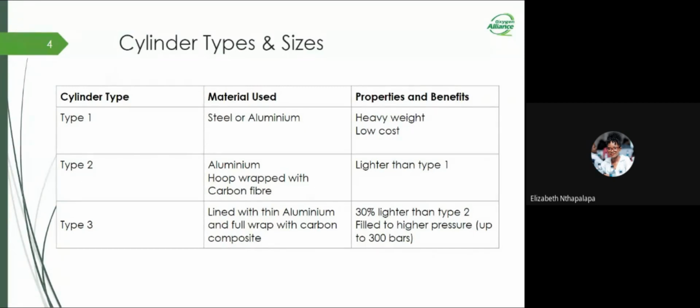So for us not to bring in conflict by bringing any magnetism around, we are still trying to use material which is non-magnetic. Even the composite itself is non-magnetic. So it is just another soft solution to any magnetism problem that can arise as we use the MRI machines. I hope that will be helpful and will help our understanding. Thank you.